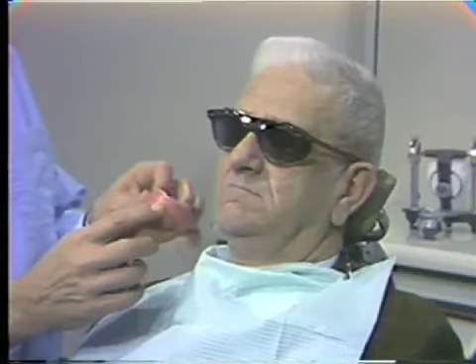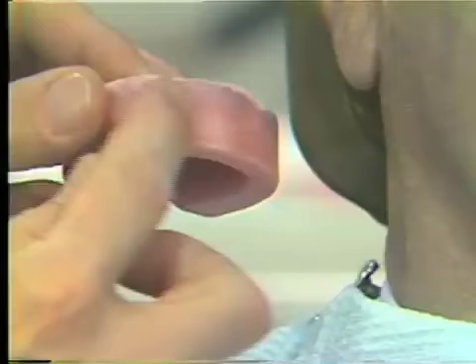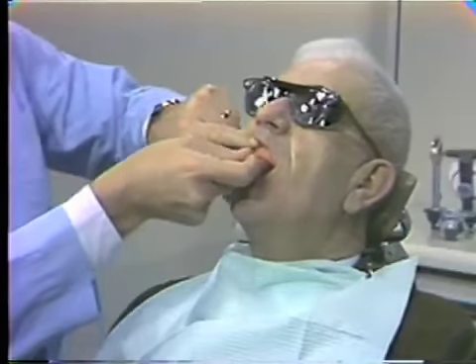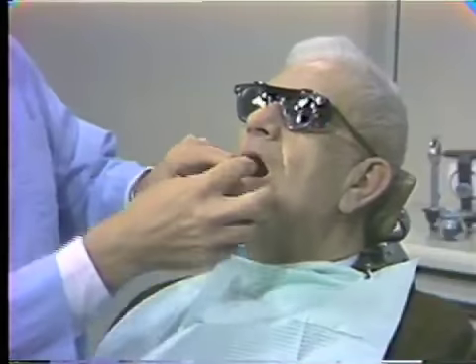We now have removed the excess wax, and we've removed some across the front where we were a little bit on the bulky side, so we'll place this back in the patient's mouth now and double check ourselves. Now, if you'll just close together for me, that's fine. Now that's great. That looks real nice. And now we'll check from the profile and see that we have just about the right amount of lip support for Mr. Monahan. So at the present time, we now have, we hope, our tentative vertical dimension of occlusion.